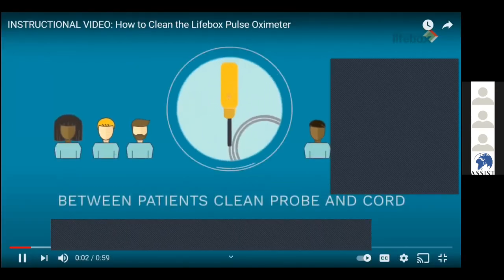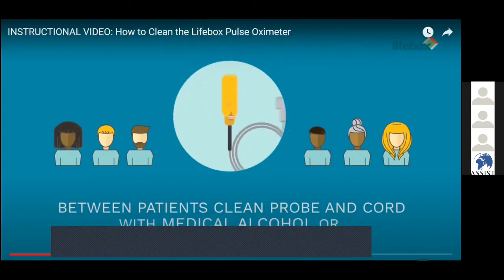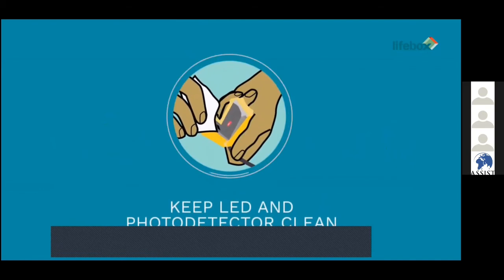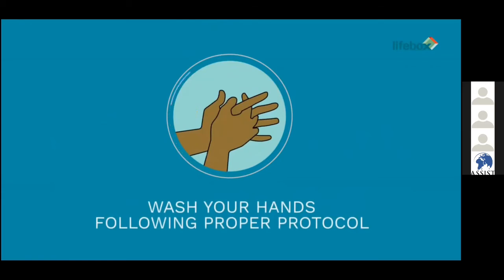Between patients, it is essential that you gently clean with medical alcohol. Small amounts of 70% alcohol-based hand rub will also work, but should be applied sparingly. It's important to keep the LED and photo detector clean. Please also remember to wash your hands following proper protocol between patients.